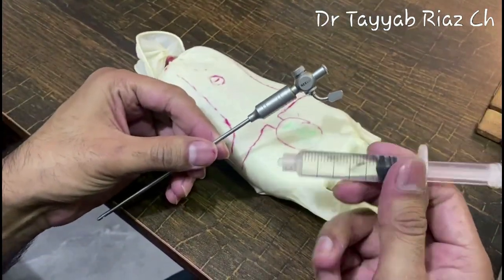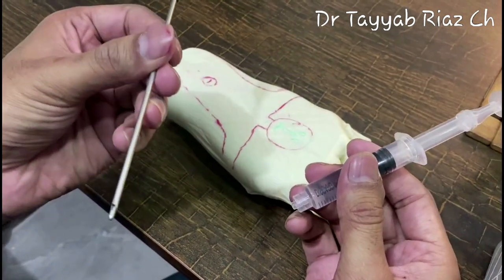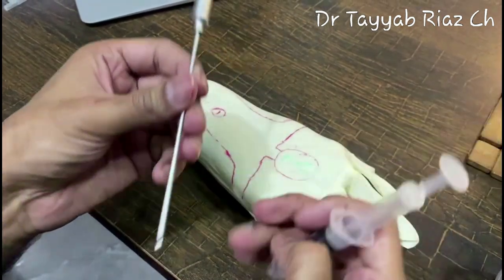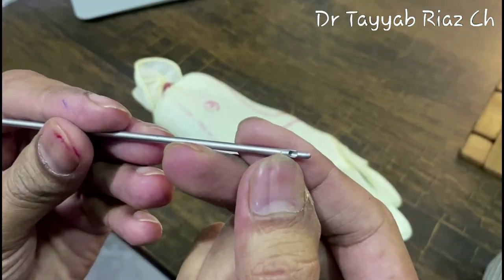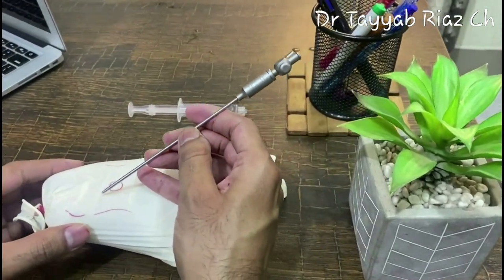After passing the Veress needle, the first test to be performed is the irrigation. And why irrigation? While going through the abdominal wall, if any tissue or part of the fat is stuck in the side eye, it will get washed out with the help of the irrigation.